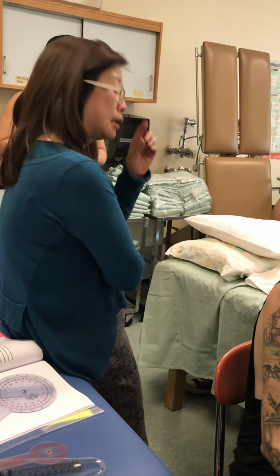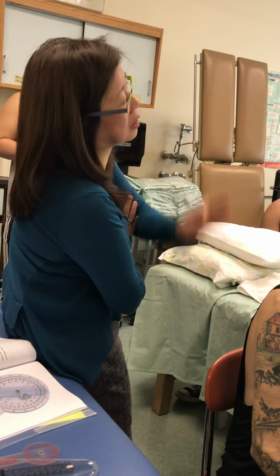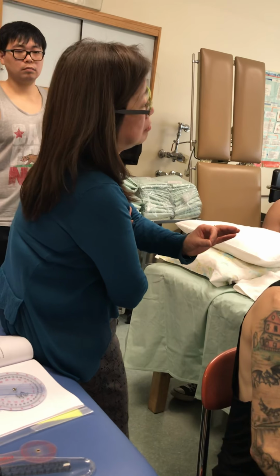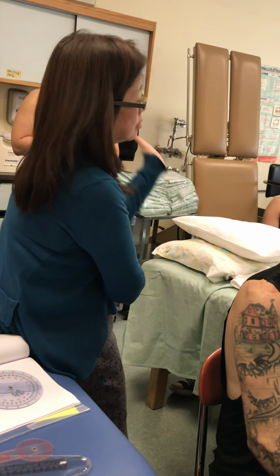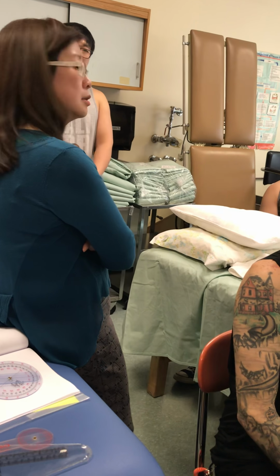But as long as you know what the starting number is and what your end number is, you know if you pass the anatomical 0, if you're starting on the other side of the direction, then you know what you have to document.